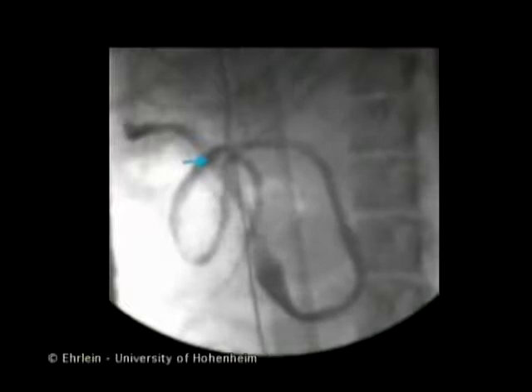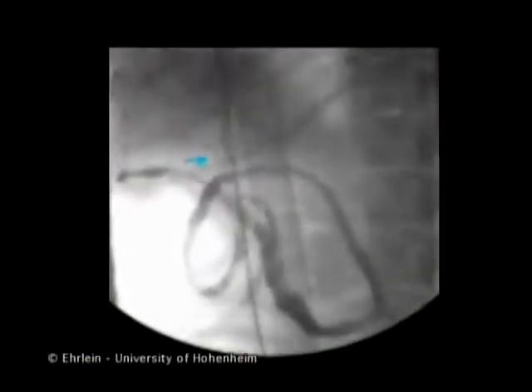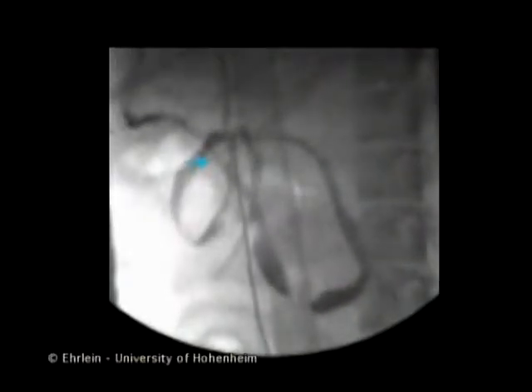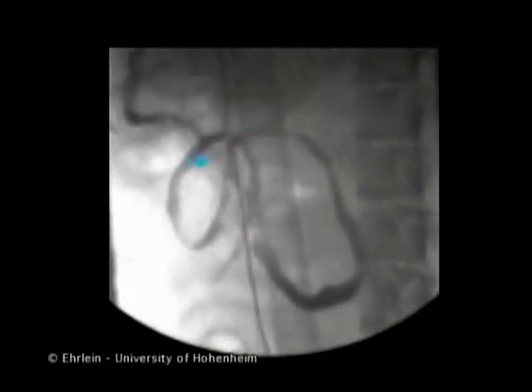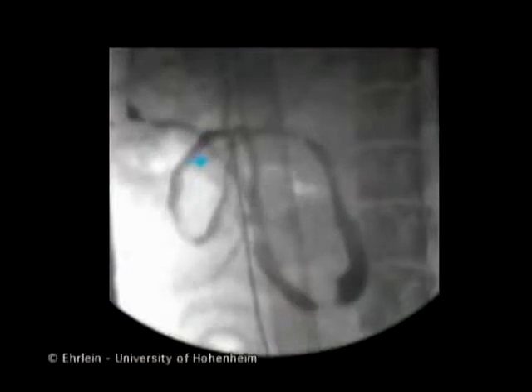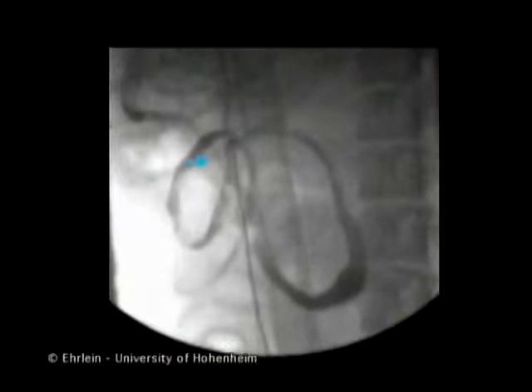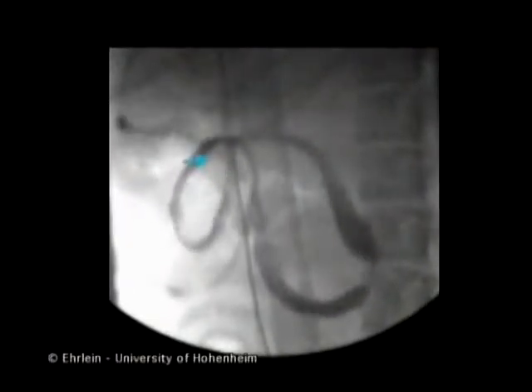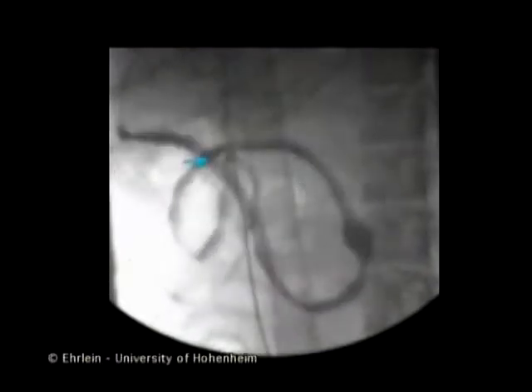When the peristaltic waves have reached the proximal jejunum, the phase 3 begins to migrate aborally. This is produced by each subsequent wave starting and terminating a few millimeters further distally. Here we observe the aboral region of the peristaltic waves and see the aboral migration of the phase 3. The aboral migration is elucidated by time-lapse recording.